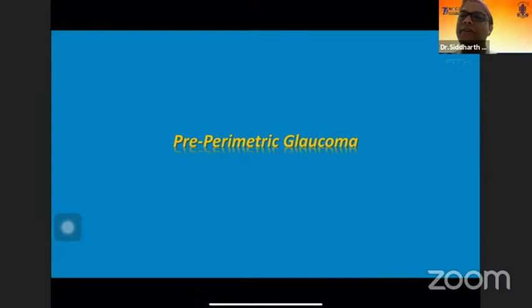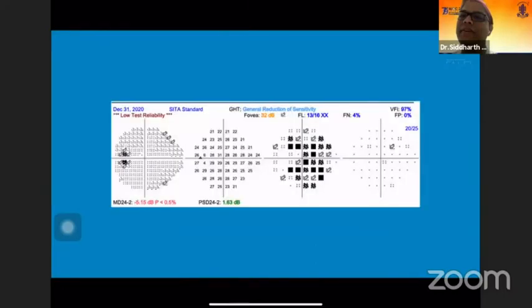So while we had the visual fields correlating perfectly well with the disc in the last two examples, there can be a situation where the visual fields fail to catch what is happening on the disc. What you see here, though it is a little unreliable disc, the pattern deviation plot does not show any defects. So this was quite repeatable, and even when we had a reliable field, there was no defect on the 24-2.